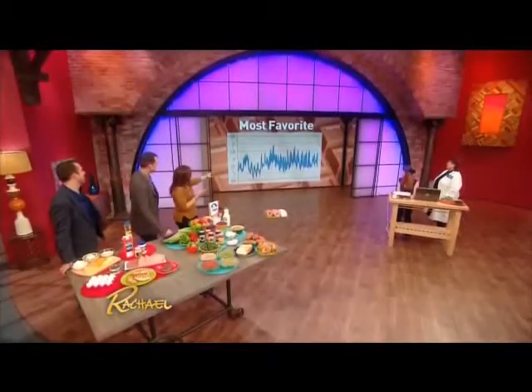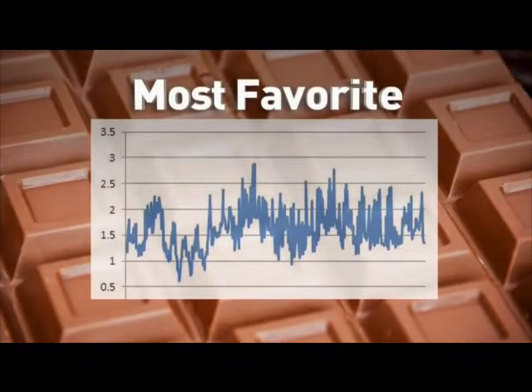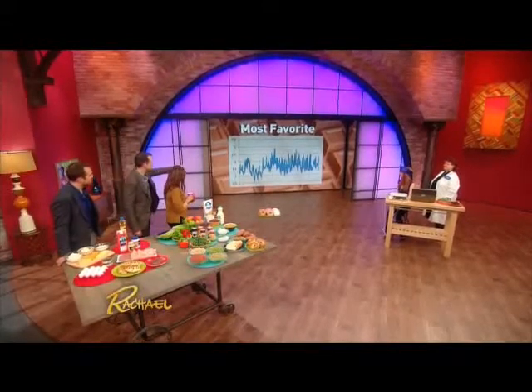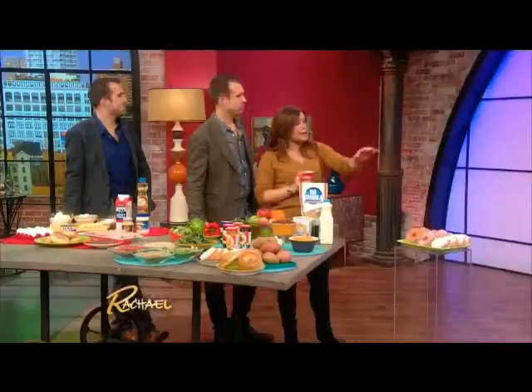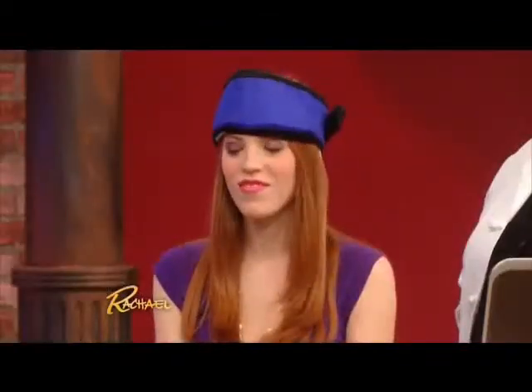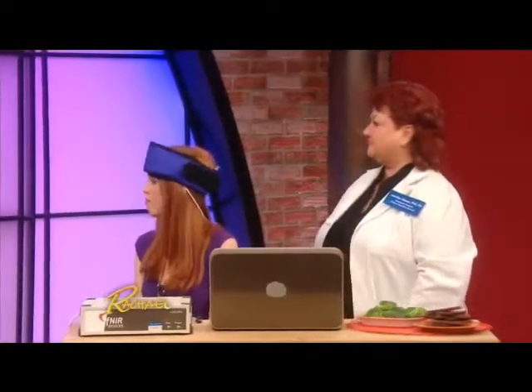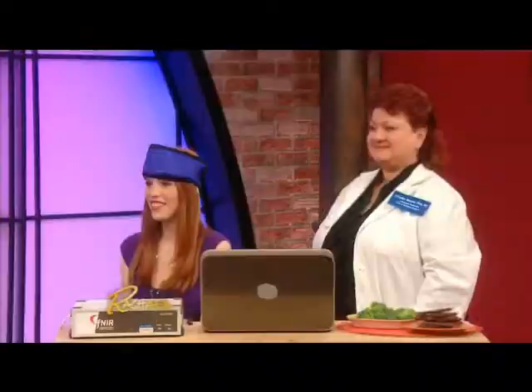So this is the most favorite. So this is what her brain looks like on chocolate? Yeah. You can see the graph is more or less a flat line. There are wiggles up and down, but it continues being flat. There's no change in signal as chocolate is being eaten. And the chocolate was eaten for about 5 minutes, right? Each food was continuously ingested for 5 minutes each? About 5 minutes, yes. So that whole time, she'd have kept on going another 5 minutes. Basically, yeah. That's a bit like you eating pasta, probably. Exactly. So let's take a look at least favorite.